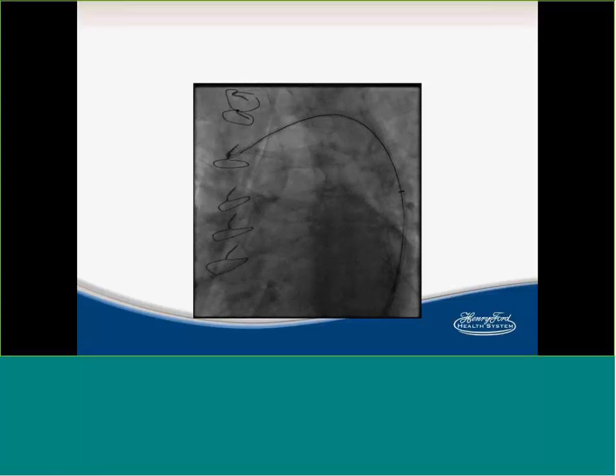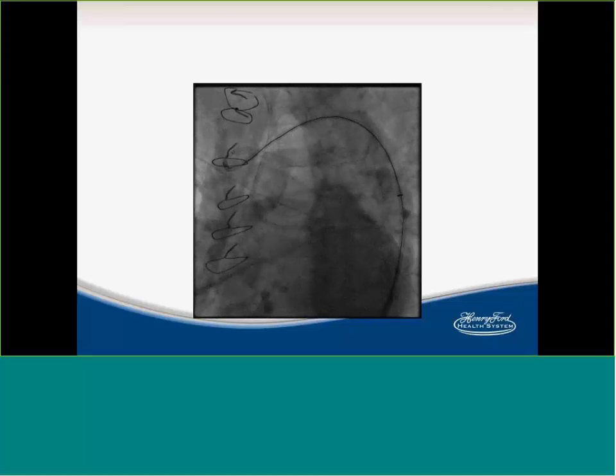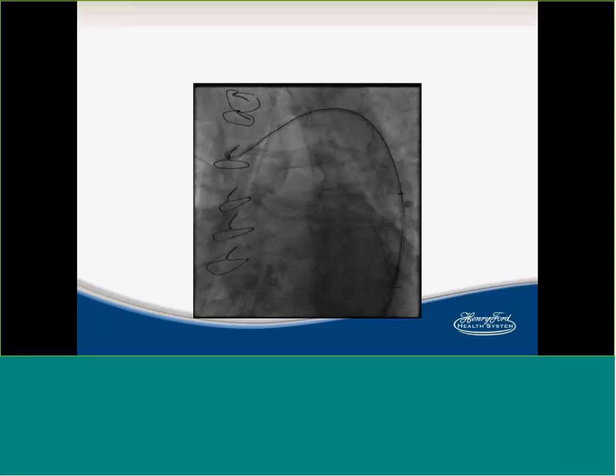So this is basically, after a long thought and debate, I decided to coil it. This is an Azur 018.